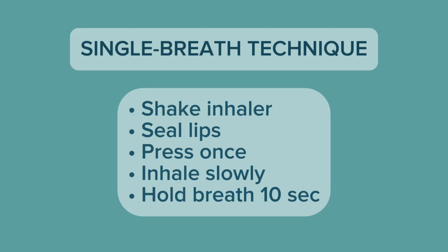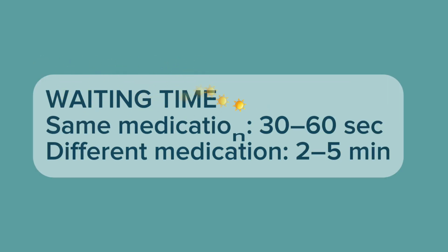Now I'm going to depress the canister. Breathe in, 1, 2, 3. Hold your breath for 10 seconds. 10, 9, 8, 7, 6, 5, 4, 3, 2, 1. I will remove the spacer chamber. You can breathe now. Patricia, I need you to rest for a little bit in between the inhalations.